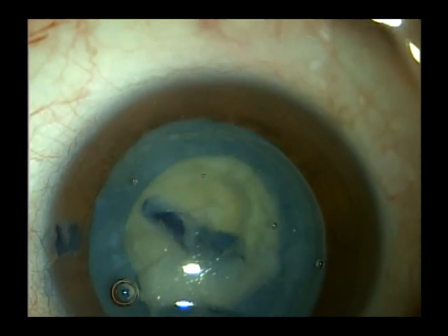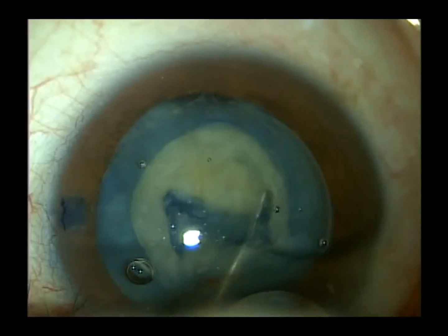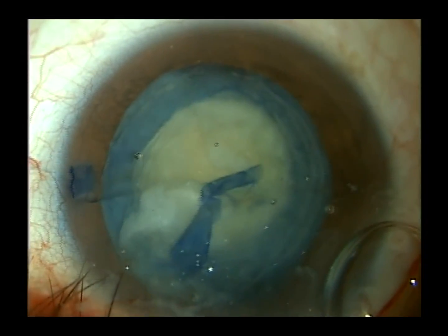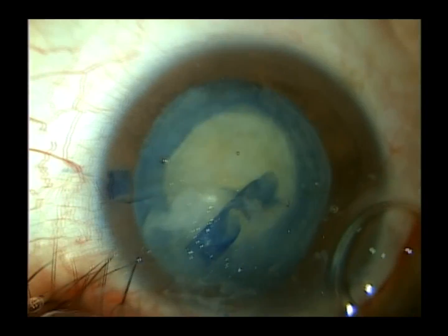Our usual cataract surgery times are around eight minutes. This video has been edited somewhat. Cases like this will take 20, 30 minutes — as much time as we really need to complete it safely.